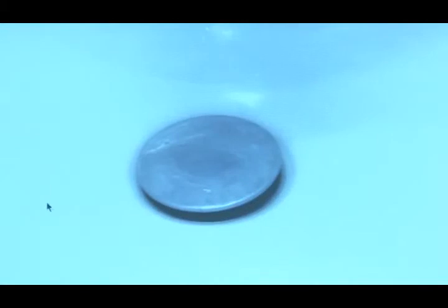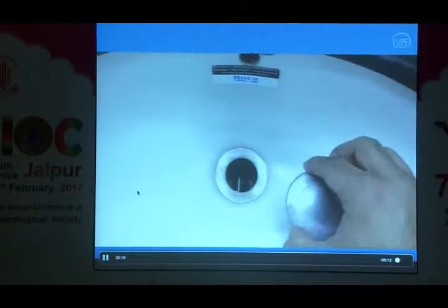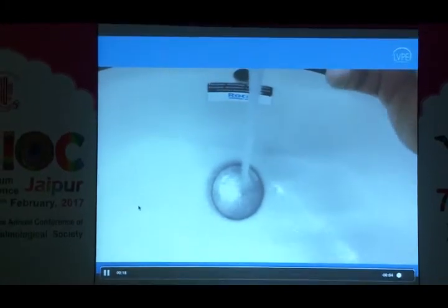Make sure that the computer is working. Wait for assistance. Okay. So you need to access the area where you want to do the filter, do the trabeculectomy, get adequate exposure, make the opening, relax the flap, and make sure that the flow is patent.